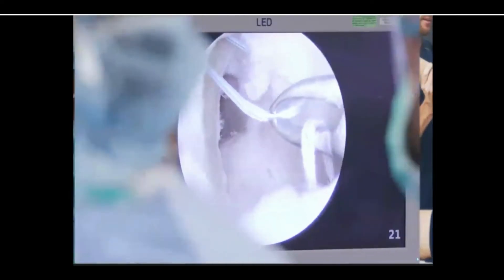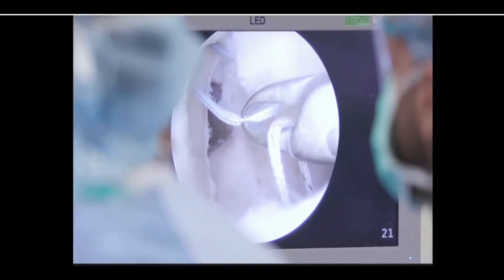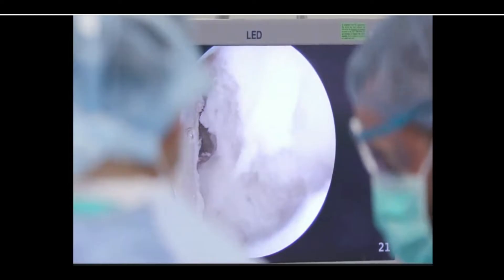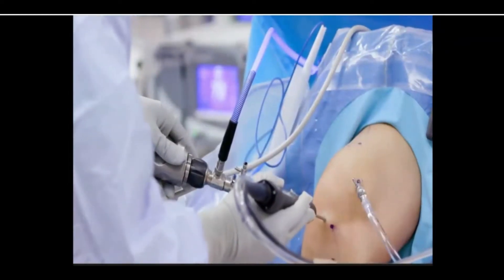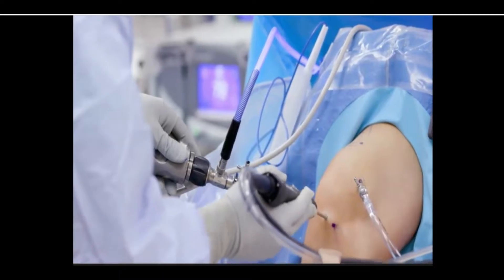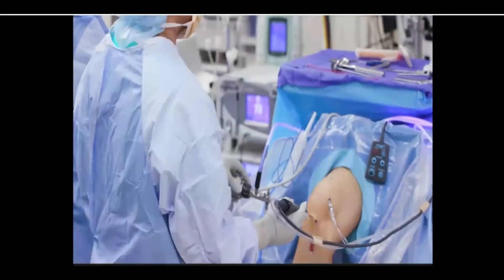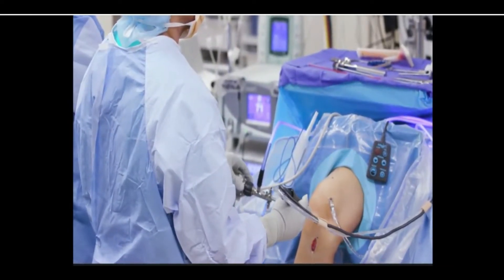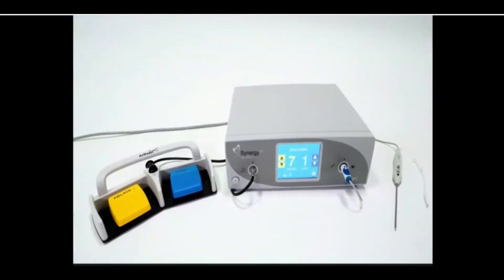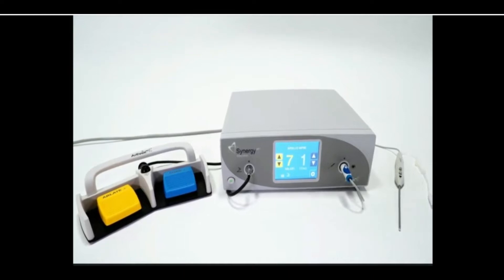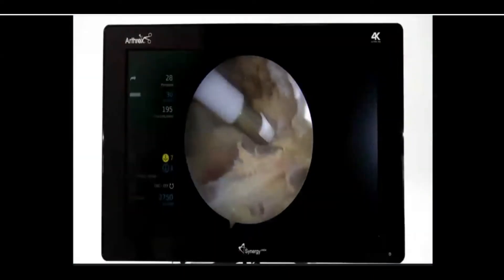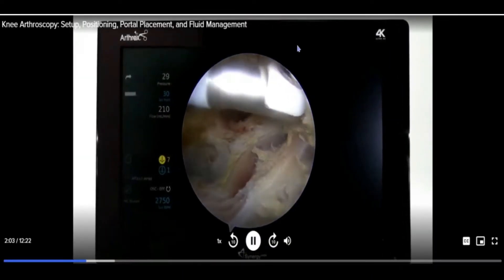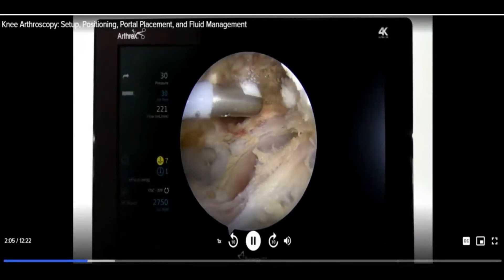To perform knee arthroscopy, the surgical team needs an arthroscopic imaging system, a fluid management system to control intra-articular fluid pressure and provide an aqueous environment, and consoles to power various arthroscopic instruments such as a shaver handpiece or radiofrequency probe for resecting tissue.